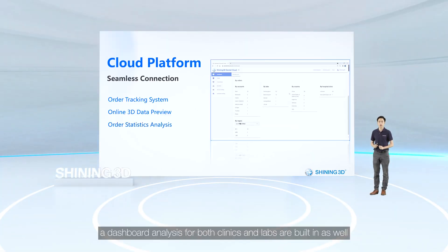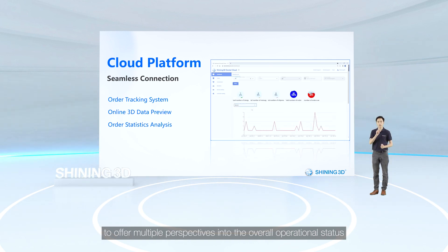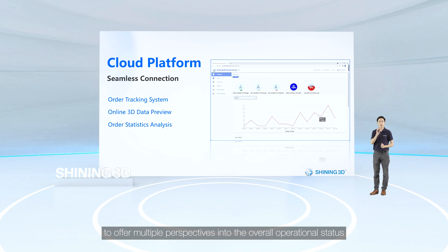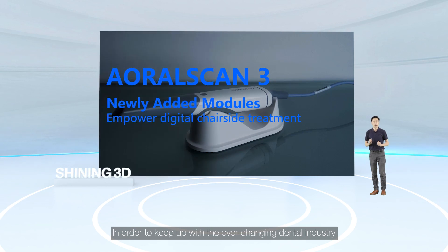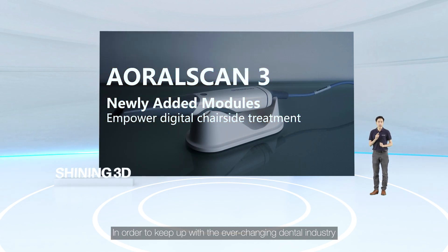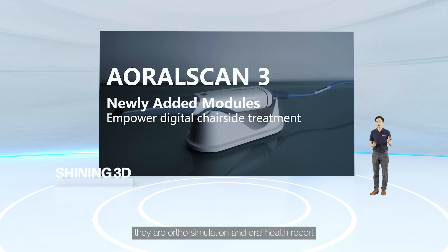In case a rescan is needed, technicians can also reach you through this platform. Last but not least, a dashboard analysis for both clinics and labs is built in as well, offering multiple perspectives into the overall operational status in order to keep up with the ever-changing dental industry.